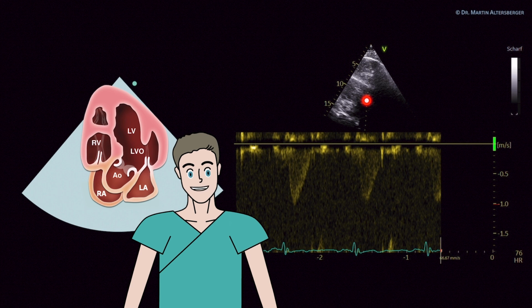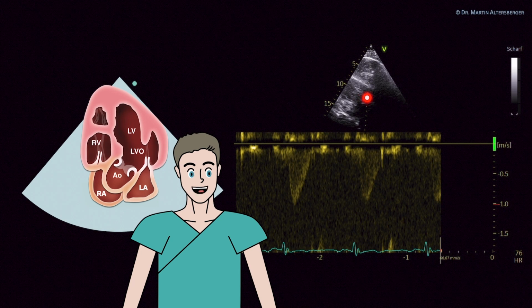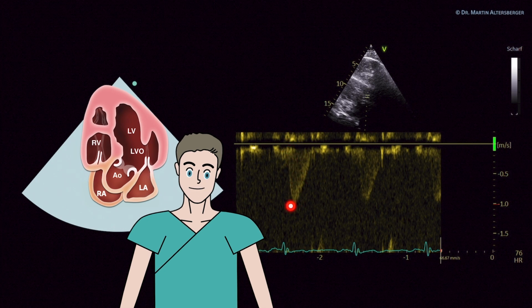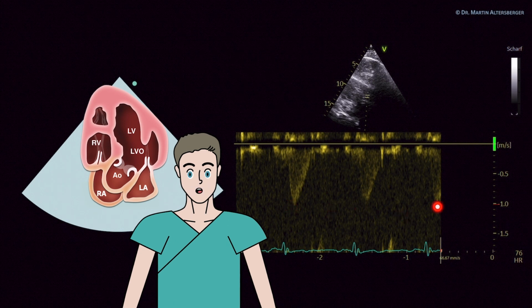And here you place the pulse wave Doppler at the area of the LVOT. First, I would recommend that you place it in the aortic valve, move a bit backwards, and then you get this nice flow signal with a black curve in the center, which then is the LVOT curve, where you see it's also around 1 meter per second, which is normal.